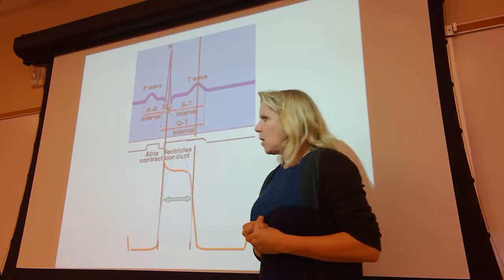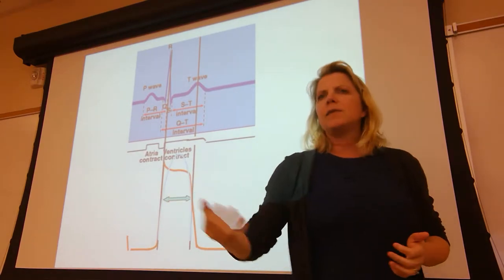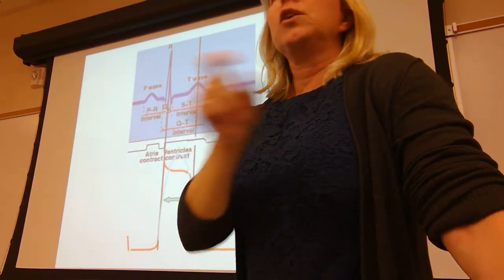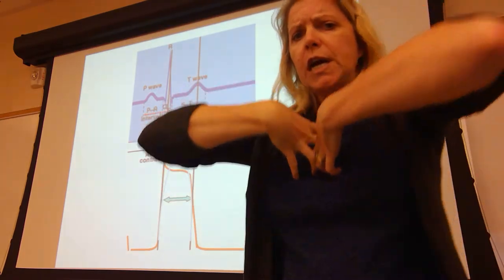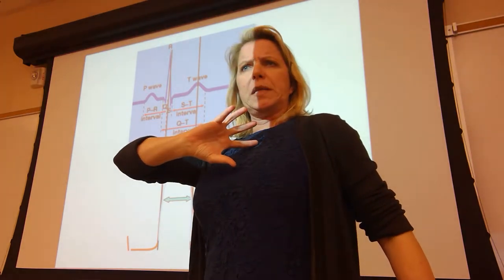So please, from now on, when you look at an EKG and you're looking at this patient, when you see the ST segment, even though electrically it looks like nothing is happening, I want you to think inside, if you could cut open that patient's chest, you would see the ventricles doing this.